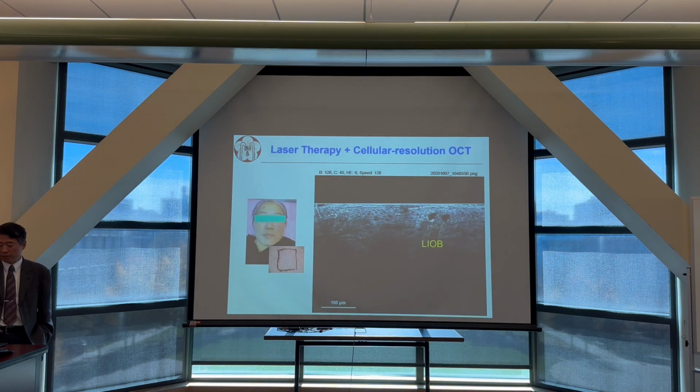We also have some collaboration with aesthetic medicine doctors. For example, these days, you heard about people using the picosecond laser, femtosecond laser on your face to, for example, remove the nevus, or try to stimulate the collagen. When you use the picosecond laser or femtosecond laser, usually the physician doesn't know, you can generate holes beneath your skin.